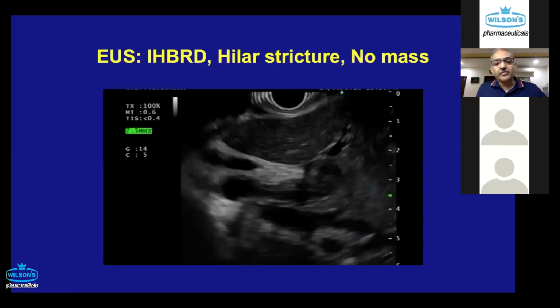Ascending up in the bile duct, now looking at the hilum area, it's not as good as the lower and the mid CBD, but nevertheless, it gives an answer because current technologies for the hilum are all, I would say, suboptimal. They haven't reached perfection as yet. You can see something on MRCP, but you need to take a biopsy because cholangiocarcinoma or gallbladder cancer are the commonest things here, which mimic any benign biliary strictures in the hilum. And differentiating the two, you need a tissue.